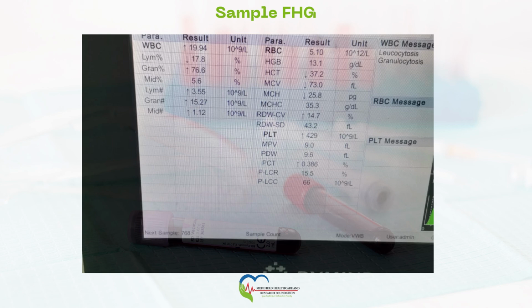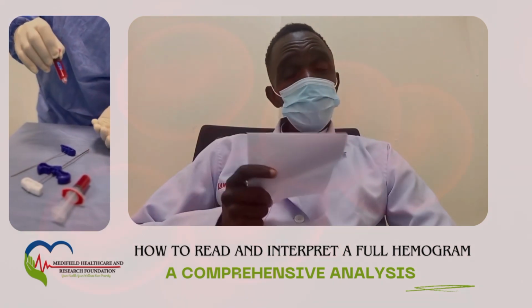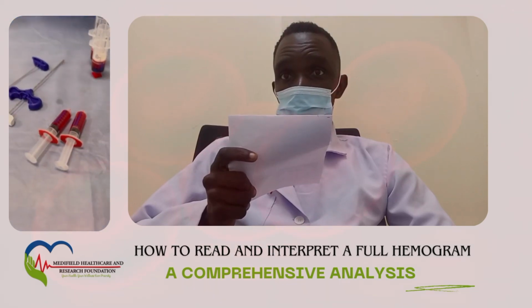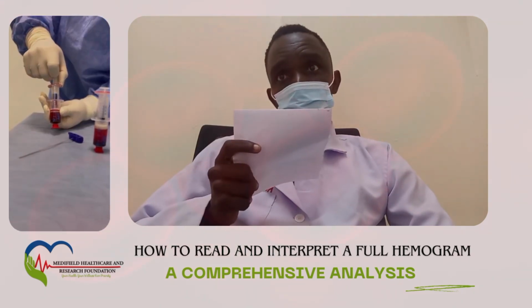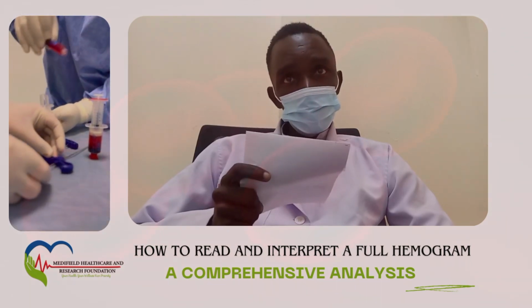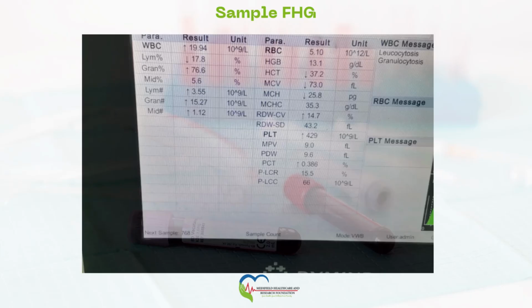And this could be because of the infectious process as well. If it's not corrected, it could soon affect the HB and the total RBC count. Another thing that is important here is the RDW, the red cell distribution width. We say that if it's high, it signals malabsorption.